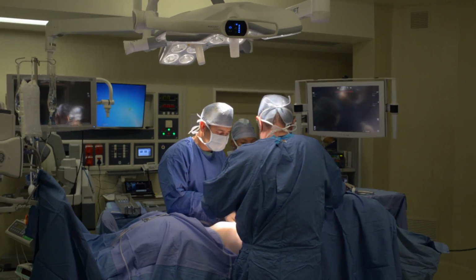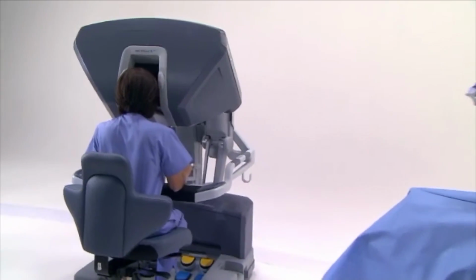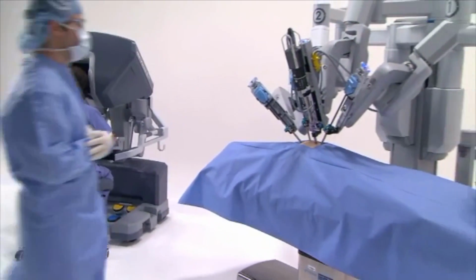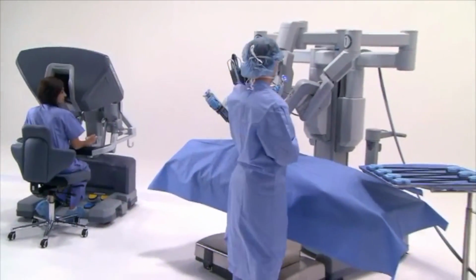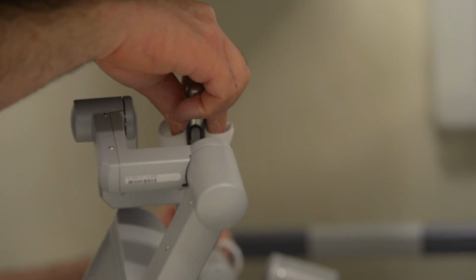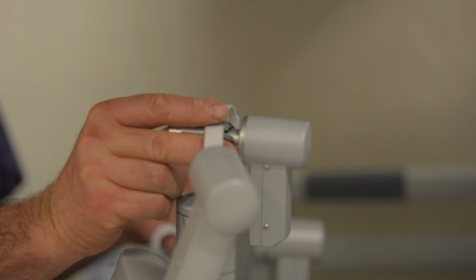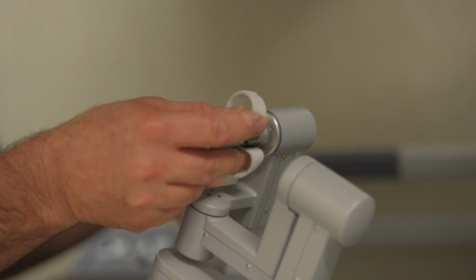Started doing pelvic procedures with the robot after the robot was introduced in Mediclinic Durbanville in 2013, and it's been used by the urologist to do mostly prostate surgery. Pelvic floor procedures means prolapse in females, either rectal or vaginal prolapse, and then rectal cancer patients we want to help with the robot. The advantages of the robotic instruments are that we can reach low down into the pelvis, where the laparoscope has got straight instruments and we can't negotiate the curvature of the pelvis.